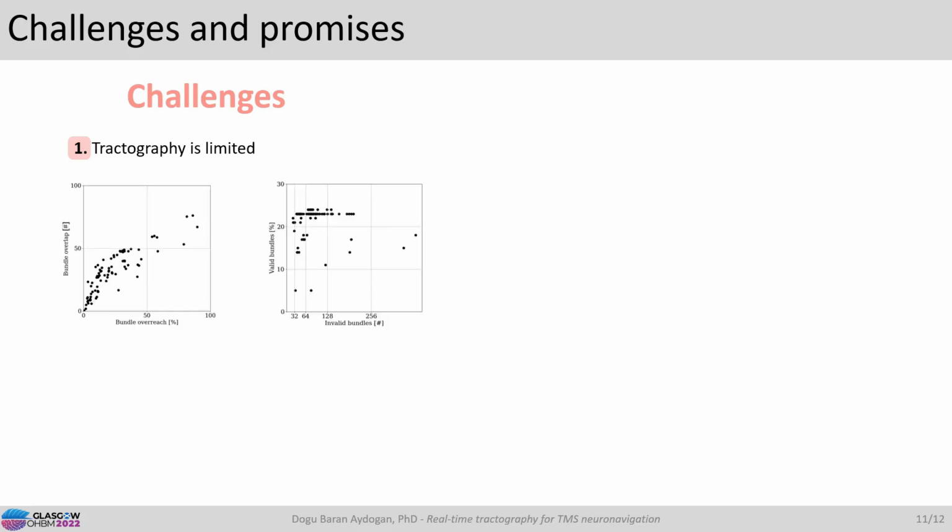These are known problems of tractography which we are continuously addressing to improve. If you are curious about where Tracker performs in the ISMRM 2015 challenge, it's about in this band. So we still have work to do. But because we do not have a bulletproof formula for tractography yet, we need to augment it.